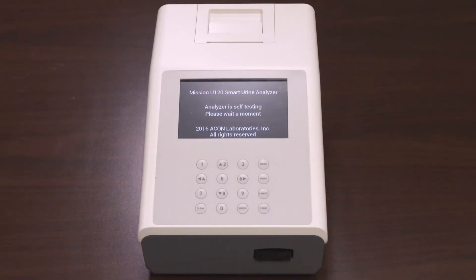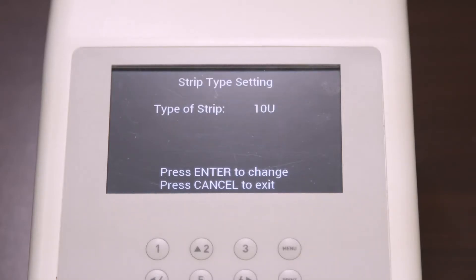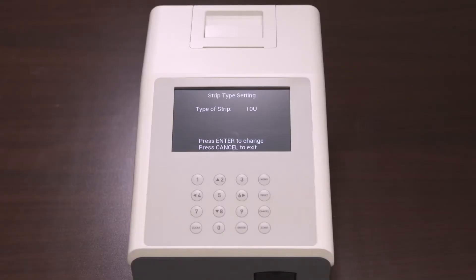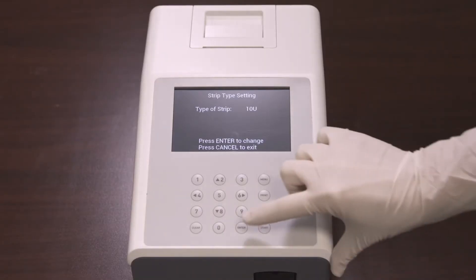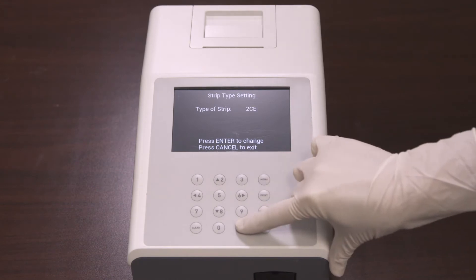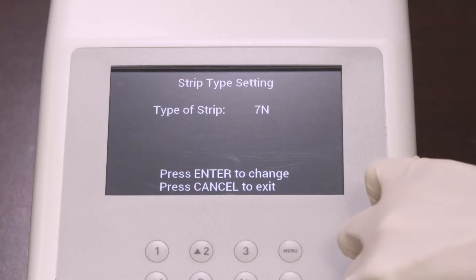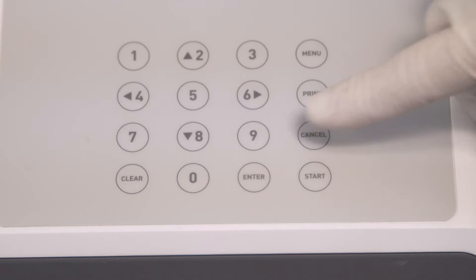Once the analyzer is turned on, it will run a self-test. After the self-test is completed successfully, the following screen will appear. Verify that the strip type showing on the screen corresponds to the type of strip that you will be running. If it does, press Cancel to reach the main screen, also called the initial screen. If the strip type on the screen is not the strip type you intend to run, press the Enter key to cycle through the available strip types until you reach the one you need. Once the desired strip type shows on the screen, press Cancel to reach the initial screen.